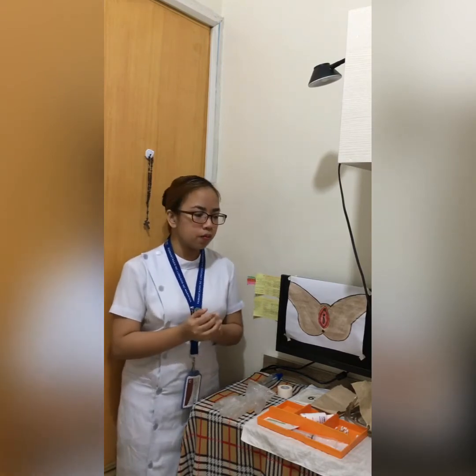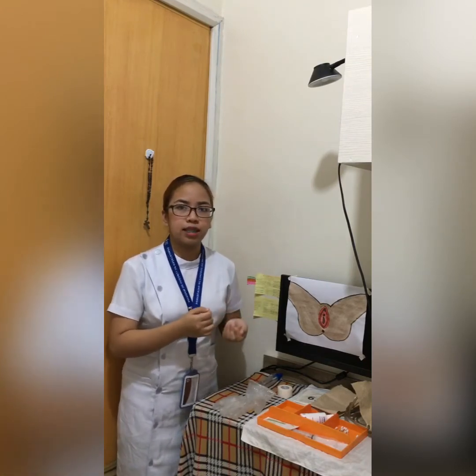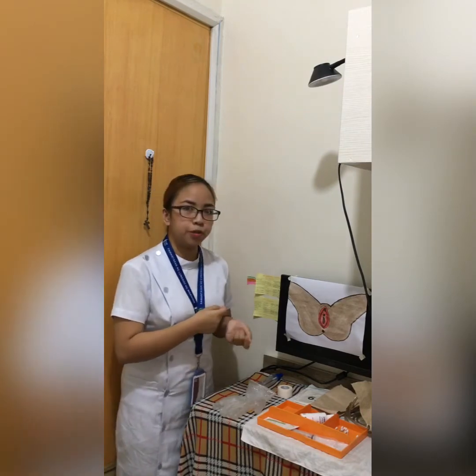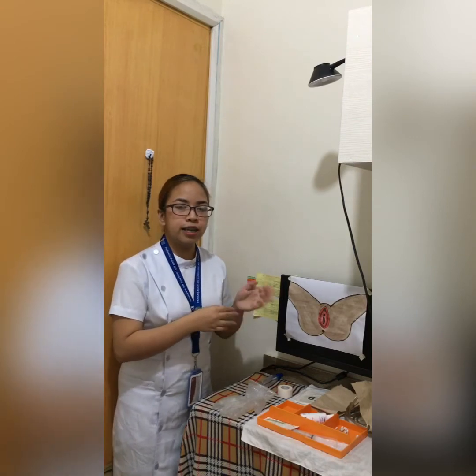Place the client in supine position with knees flexed about 2 feet apart and the hips slightly externally rotated.